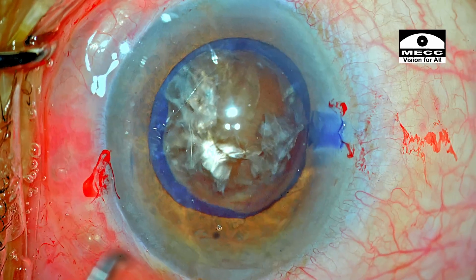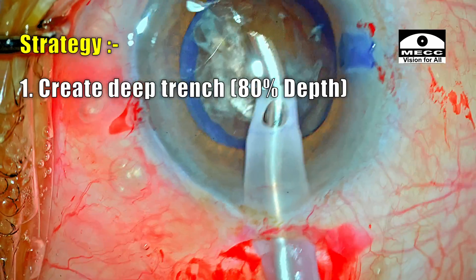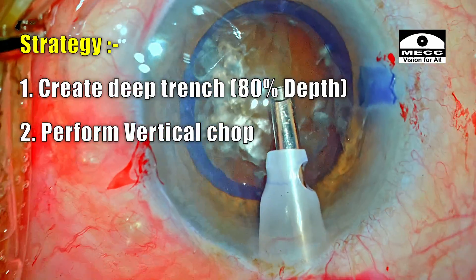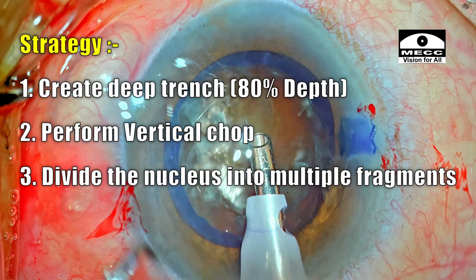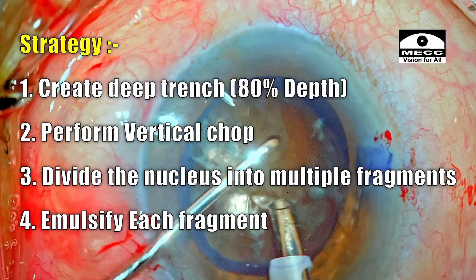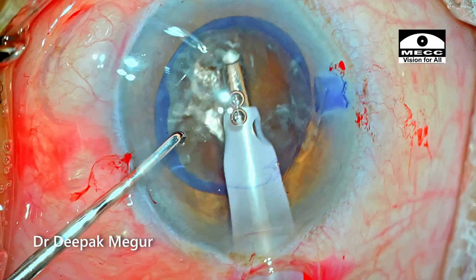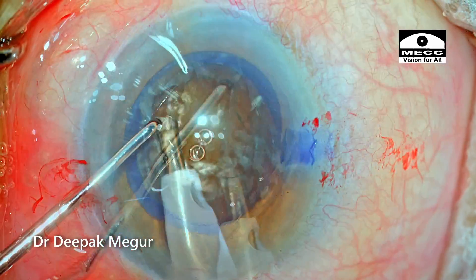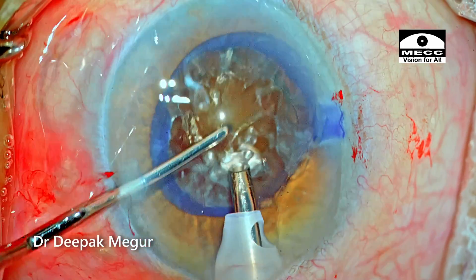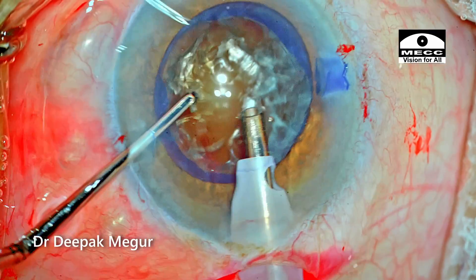Time to emulsify the nucleus. The strategy is to use sculpt settings to create a central deep trench of about 80% depth, then perform vertical chop to divide the nucleus into at least six smaller fragments, then switch to quadrant settings to emulsify each fragment. Before starting phaco power, I use epinucleus settings just to ensure flow is established, aspirating the superficial cortex and OVD without any phaco power.